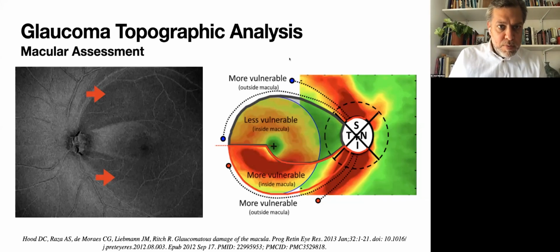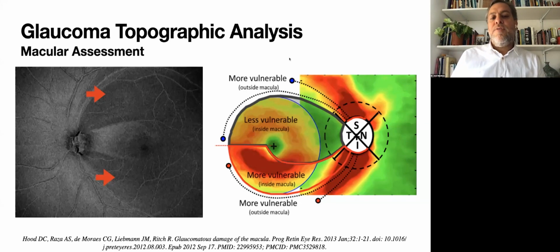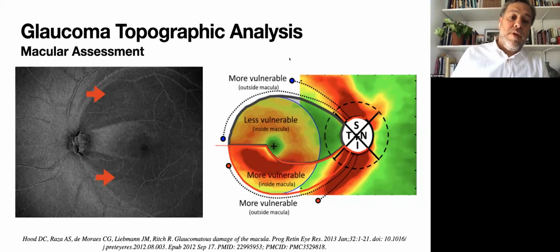What's the meaning of the 2 in 30-2, 24-2 and 10-2? The 30 stands for 30 degrees, 24 is 24 degrees, 10 is 10 degrees, and the 2 stands for the number of points that are being tested, the pattern of locations.